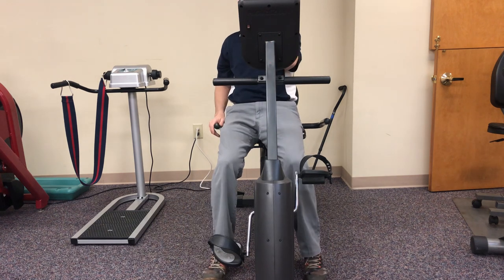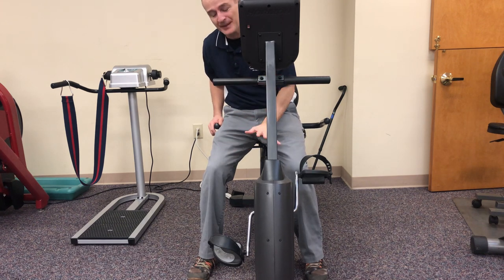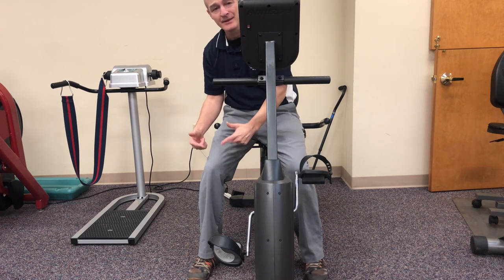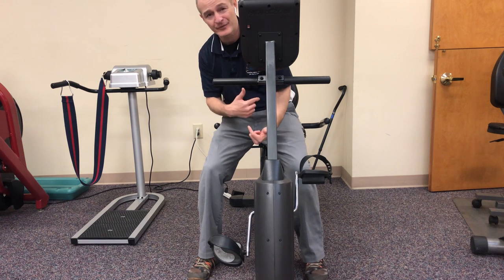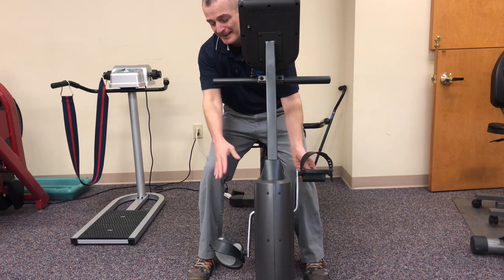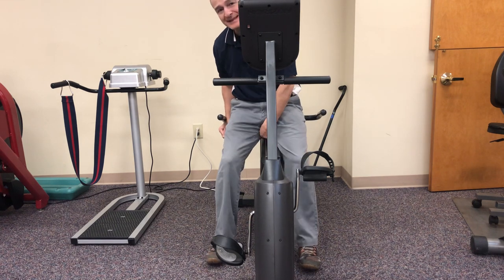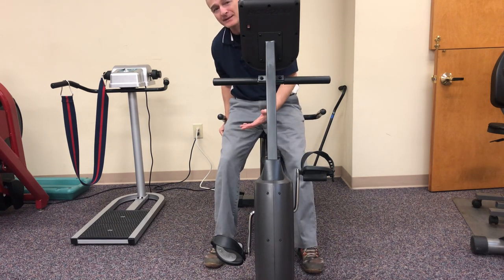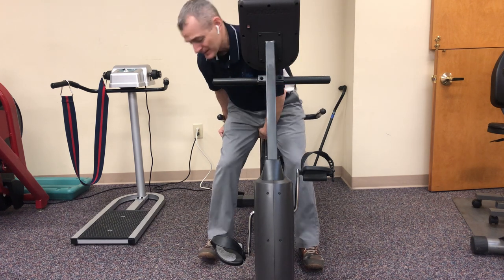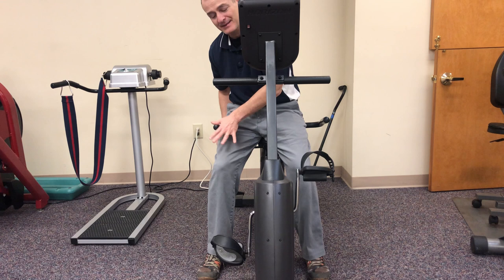Probably the first and most important thing is always going to be the setup. We want to make sure that when you're putting your foot on the pedal — the surgical leg, we'll pretend in this situation it's my right leg — it could have been 24 hours ago or four weeks ago, whenever you get to use the bike. The first thing I'm going to do is release the seat so it can move. I want to be back as far as I can but still able to touch the pedal. I slide the seat forward and make sure the pedal is down on the side that had the knee replacement — this is the first foot I put into the pedal.